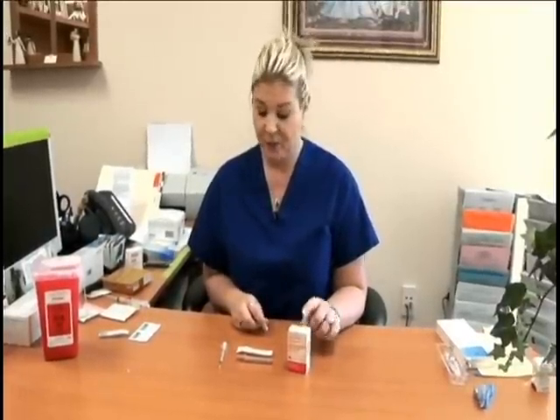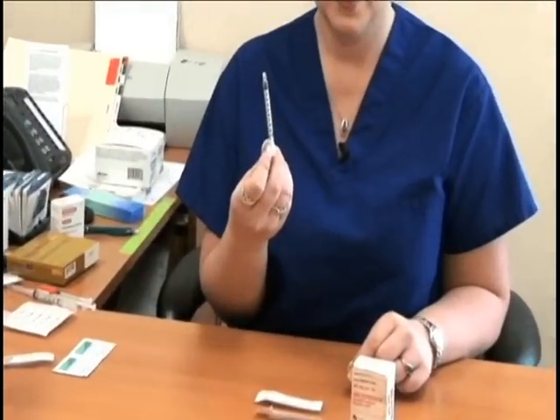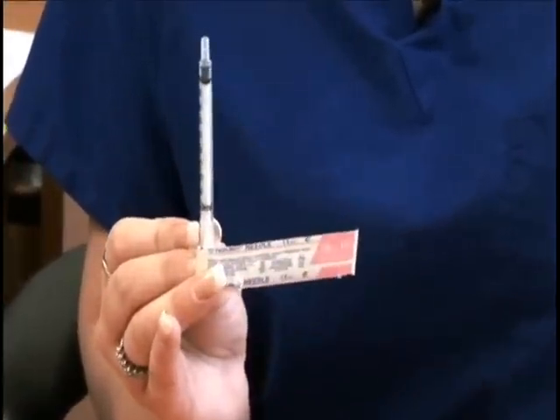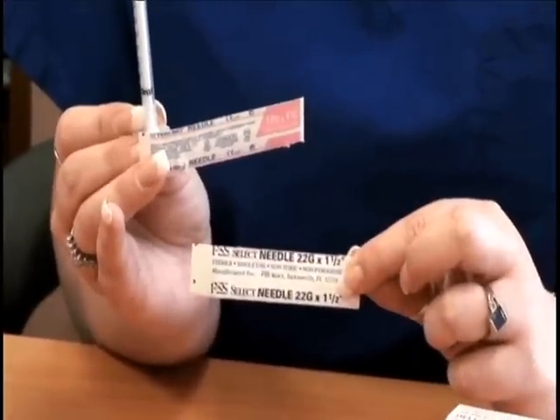This medication will be given intramuscularly, and I will demonstrate where that will be given later in this presentation. You need to have a 1 ml syringe, an 18-gauge 1½-inch needle, and a 22-gauge 1½-inch needle to administer the medication.